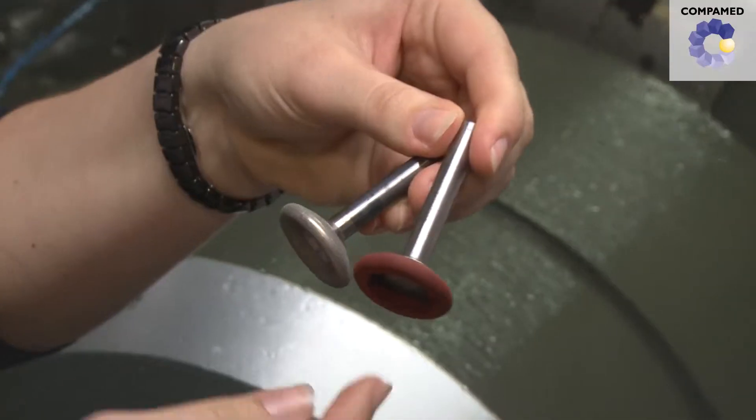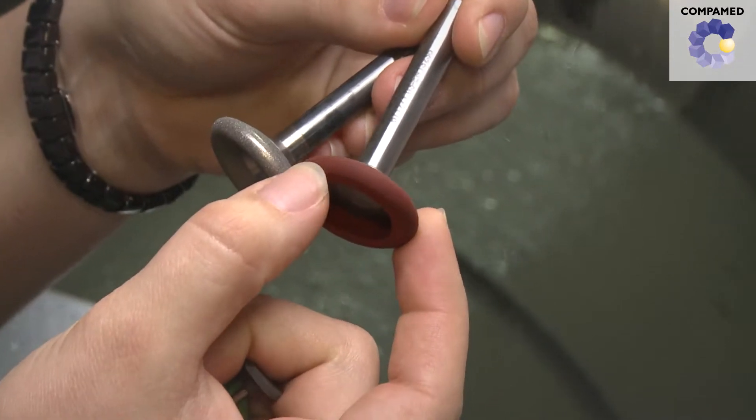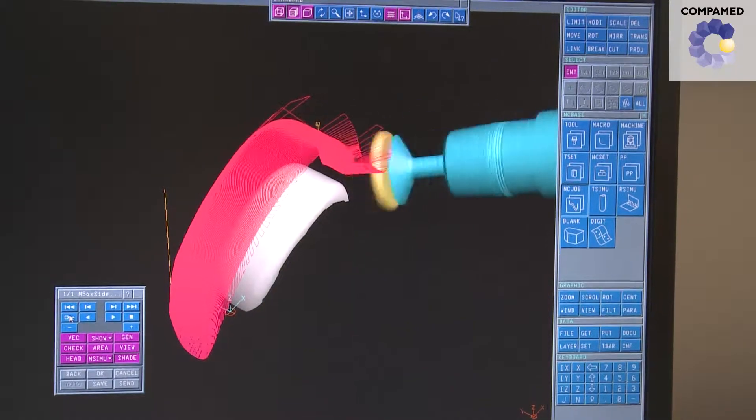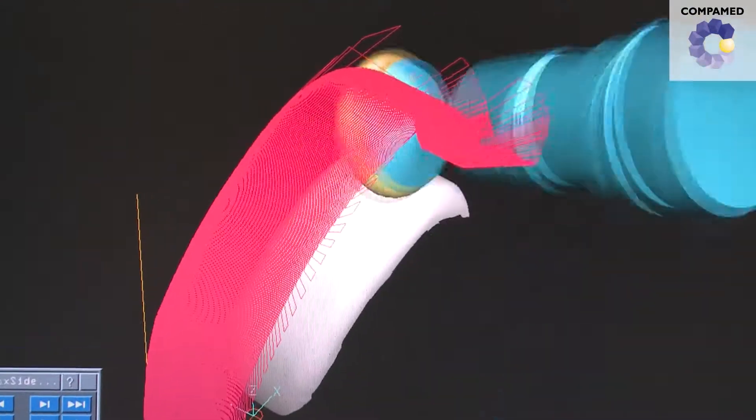We subsequently use pliable tools. One characteristic of these pliable tools is that their bond is able to adapt to the implant surface geometry, and thus no longer changes the contour accuracy produced through the grinding process. A surface roughness value of less than 20 nanometers can be achieved with this polishing process, and at the same time we no longer influence the form with the polishing process.